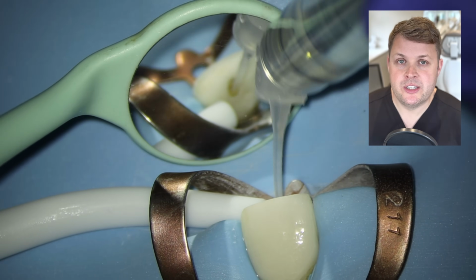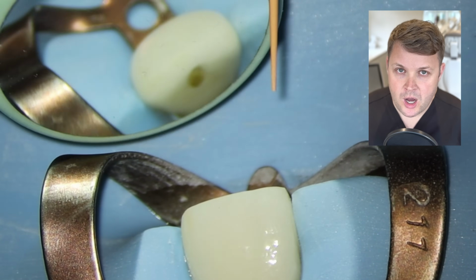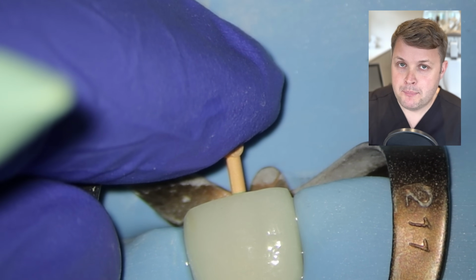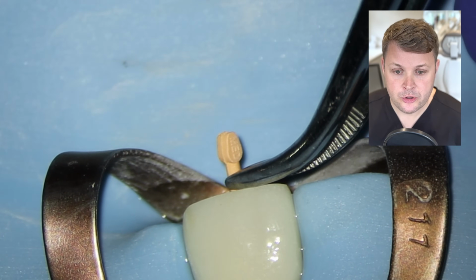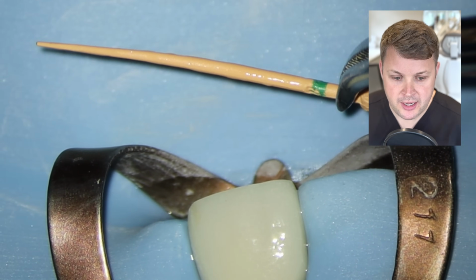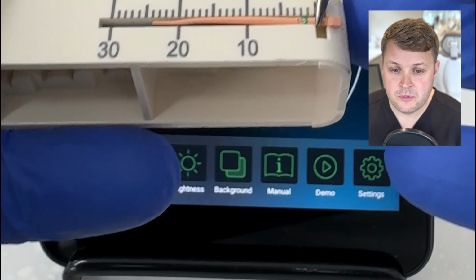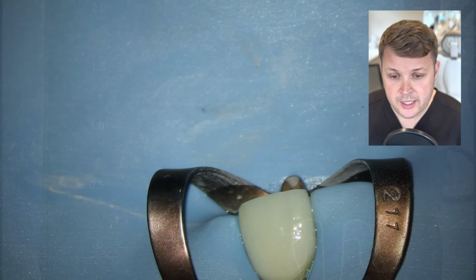That will be essentially our master apical file. We're then ready to do our cone fit radiograph, but actually as I place the matched cone, the WaveOne Gold 35 to length, it pushes past the working length, indicating that the apical end on the tooth is wider than the final shaping file. So we need to do a little bit of apical gauging. Obviously we pull this out and we can see that the GP cone fits at 24 millimeters, 2 millimeters away from our working length.